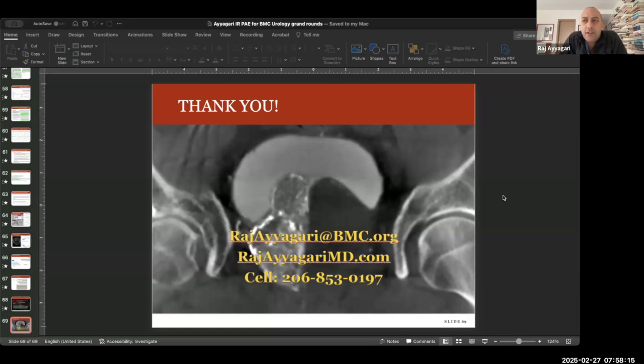Obviously, yes, it can be very helpful to map out the anatomy beforehand. I found with lots of elderly men, asking them to come for an additional appointment beforehand to get the scan done is hard. They maybe didn't have insurance, they didn't want to pay for it, or they're very elderly, in a wheelchair, and transportation is a problem. Also, they may have more marginal kidney function, and giving them that extra contrast load might be concerning.